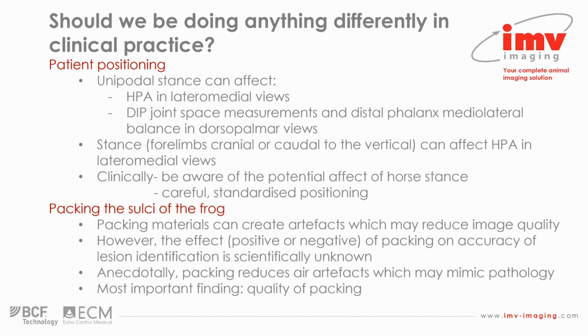And so, not putting too much in, simply putting just enough to get rid of any air artifacts within the sulci of the frogs, and also making sure it's nice and smooth so you don't have any thumbprints within that packing material.